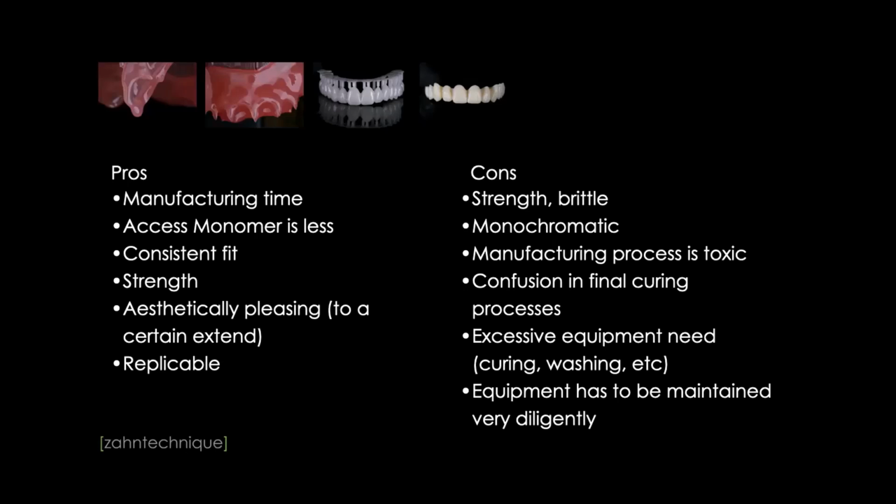For me, in my laboratory, I would love to clean like a surgical room. If you imagine, we have to clean over and over the area where you're printing. I sometimes come into dental offices or laboratories where I do consulting, and we see the 3D printing area, and I don't even want to step into that, because everything is gooky and gluey and sticky, because the resin is really tough to get off sometimes when it's not cured. So these are the pros and cons. I don't want to talk it down, don't get me wrong. It's getting better and better, but we have to be really clear here, right?